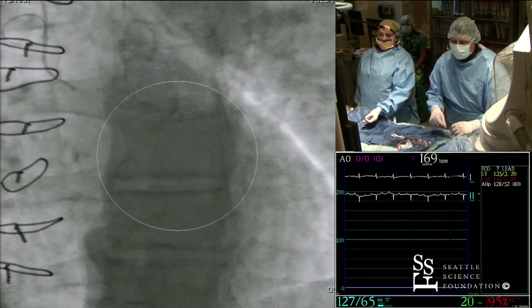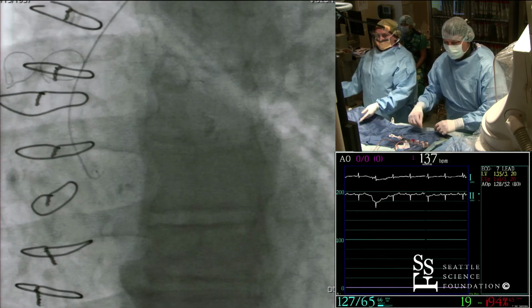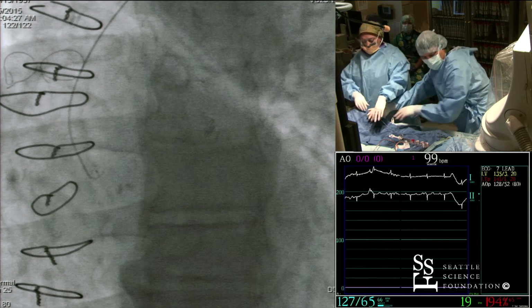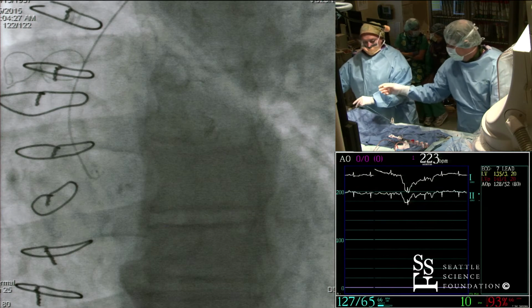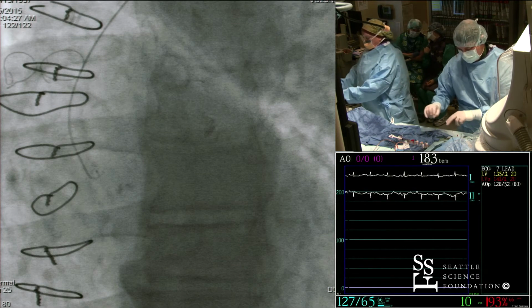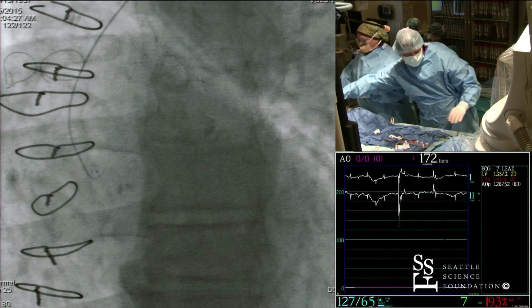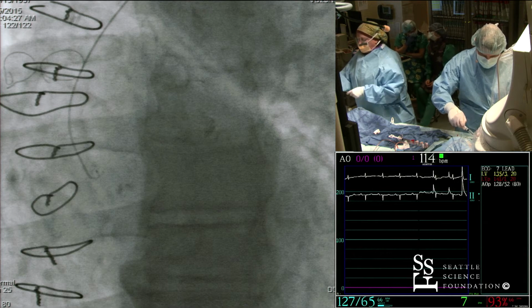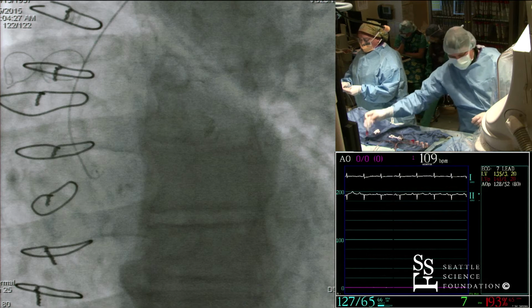So you guys use a lot of Sarahs and Jackies? Do you do that? I use Jackie. I'm sorry, I use the Tiger as my default approach for a diagnostic cath. And the Jackie is a dedicated radial catheter that allows you to engage both the left and the right coronary arteries. If you are starting with your learning curve, I think it's better to use Jackies, what you know how to manipulate. And once you feel very comfortable with that, you can start trying the Tigers.